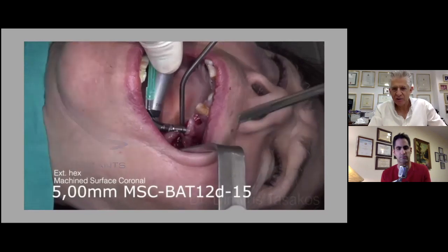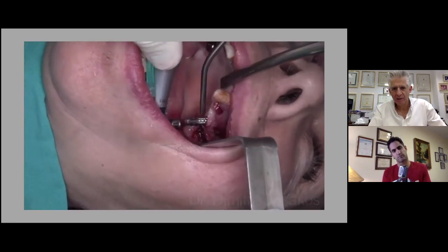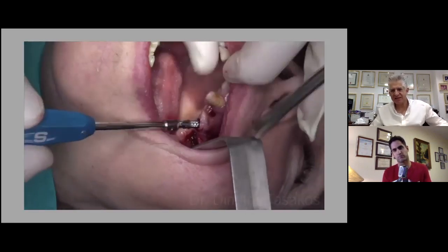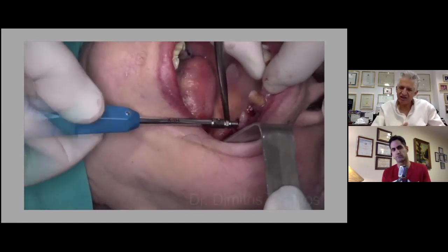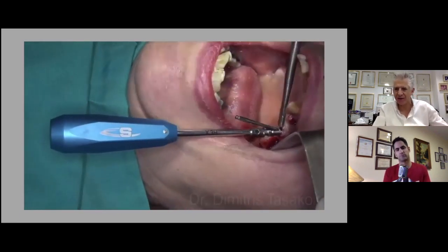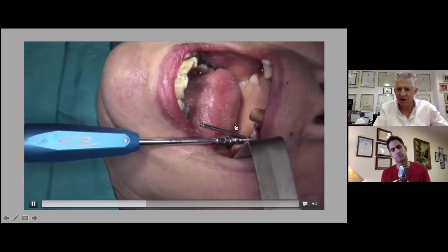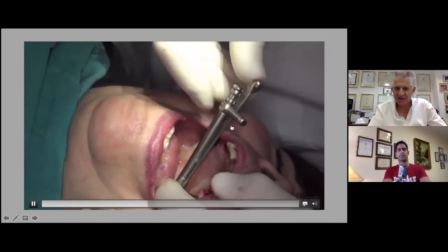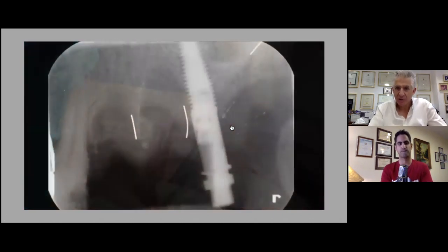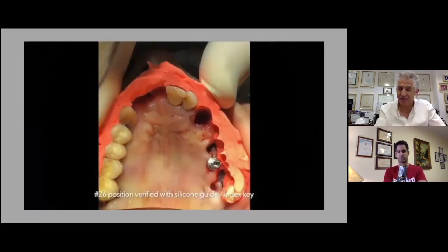This is another 12 degree implant. So basically the implant has a built-in angle which will allow for the prosthetic access hole to come out in a different angle. You see the long axis of the implant is that. That's the long axis of the prosthesis, of the prosthetic axis. Again, 100 Newton centimeter. Look how nicely we managed to utilize the available bone without getting into the sinus, without falling into this bone loss area.